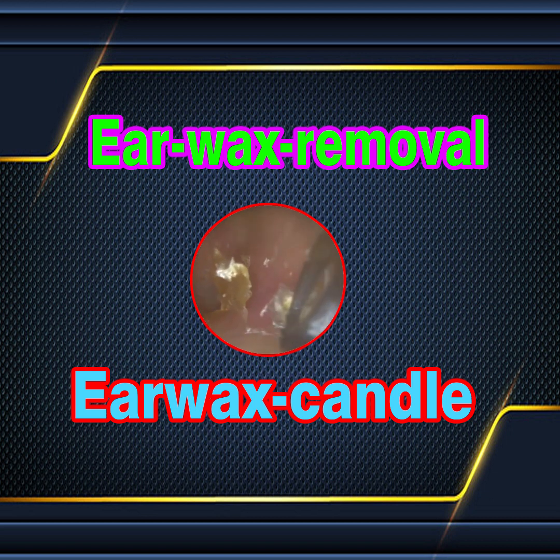So again, I'm just using the right curette, just gliding, almost like a wallpaper stripper. That's the way it kind of looks on the screen, really. But you've got to be so careful because as you glide, you're still going to account for the curvature of the ear. So in our ear canals, there is a slight incline upwards. The average is 32 degrees, but there's no such thing as averages in the ear.